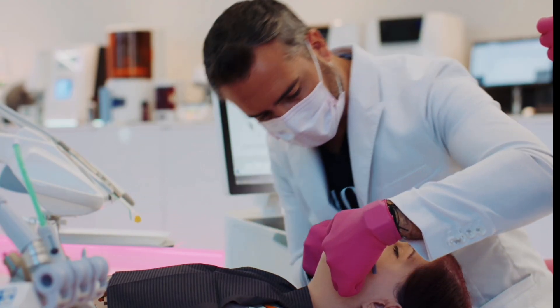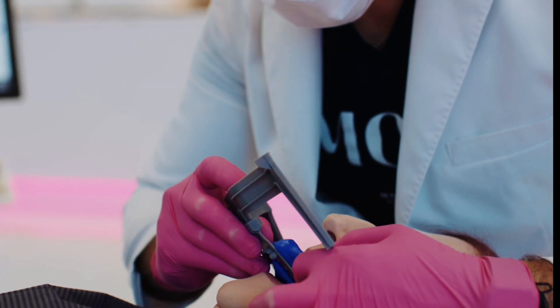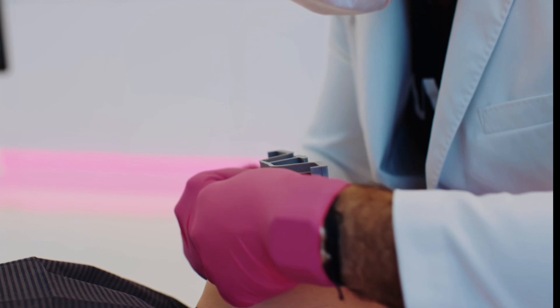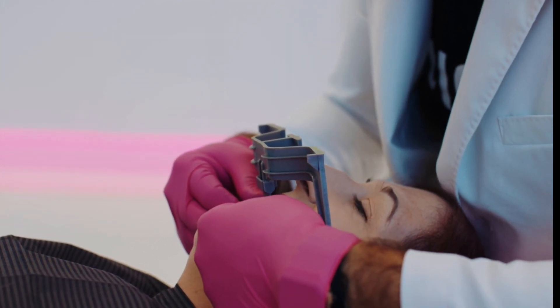Here we have an interpupillary bar and a midline bar, and we're using putty to capture an index of the maxillary arch exclusively for the purposes of pinning a bite in laboratory software.